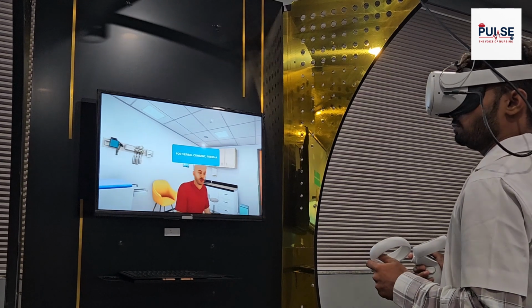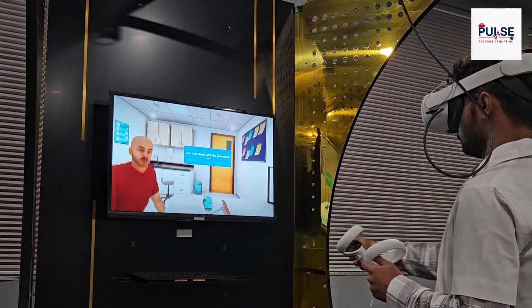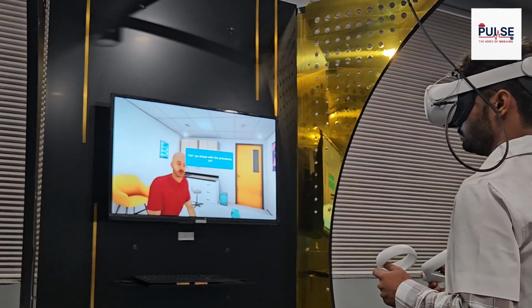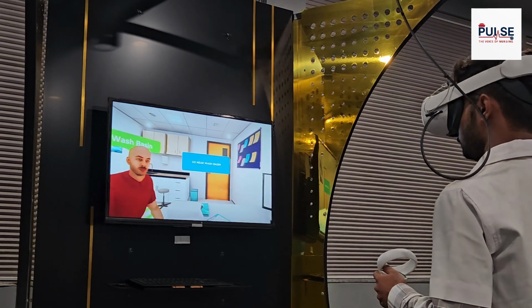Okay. For verbal consent, press A. Can I go ahead with the procedure, sir? Sure. Go ahead. Go near the wash basin.